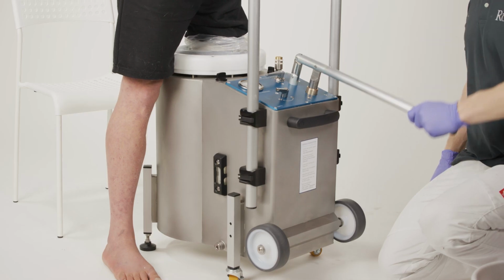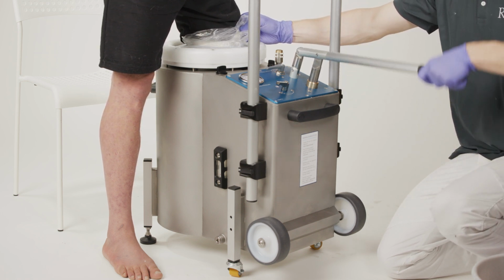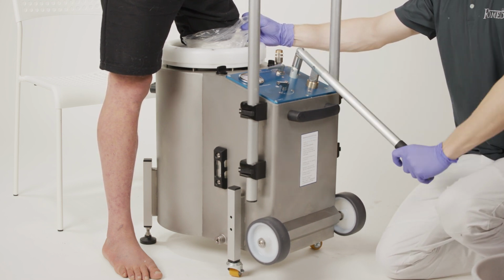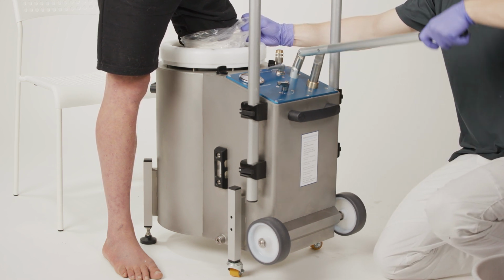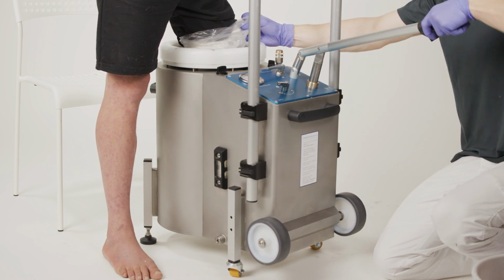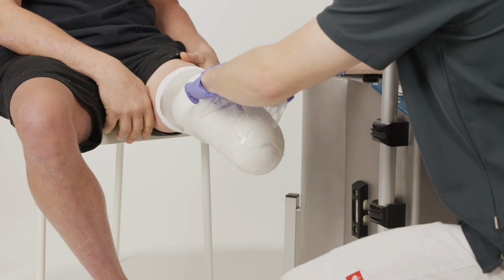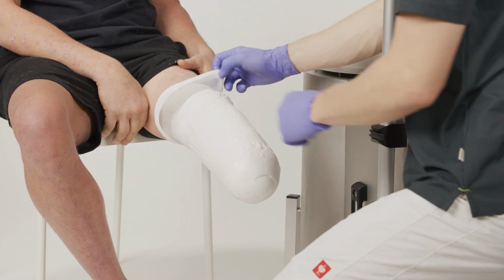The patient reduces the load on the amputated side. In order to avoid sinking deeper into the distal bearing cushion, the patient slowly pulls the residual limb out of the system as the water pressure decreases. The patient can now sit down and you can remove the film. After which the plaster impression is removed, by slowly pulling it from the residual limb.